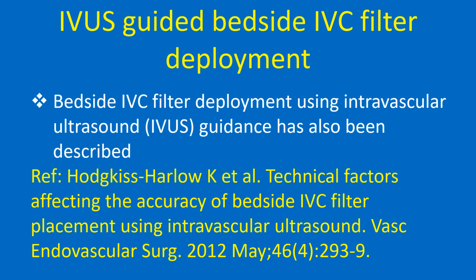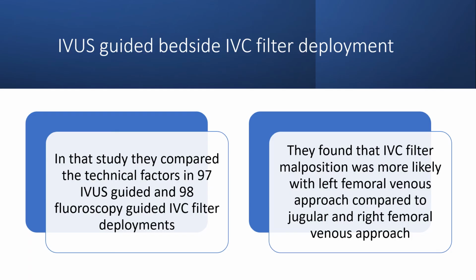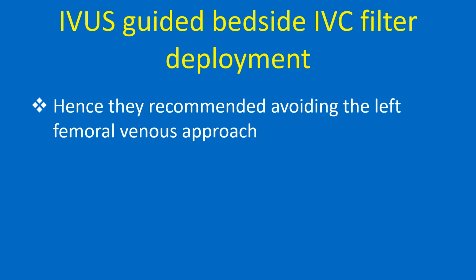Bedside IVC filter deployment using intravascular ultrasound (IVUS) guidance has also been described. In that study, they compared the technical factors in 97 IVUS guided and 98 fluoroscopic guided IVC filter deployments. They found that IVC filter malposition was more likely with left femoral venous approach compared to jugular and right femoral venous approach. Hence, they recommended avoiding the left femoral venous approach.